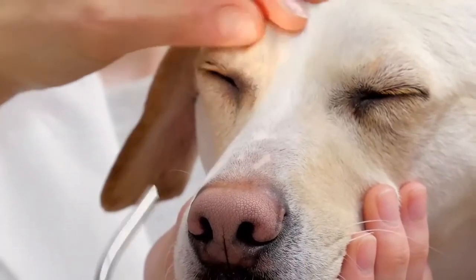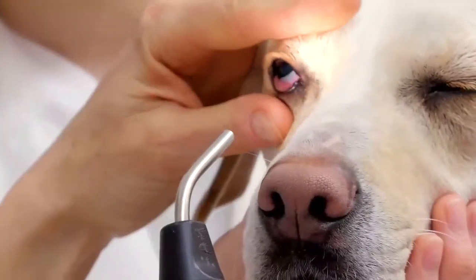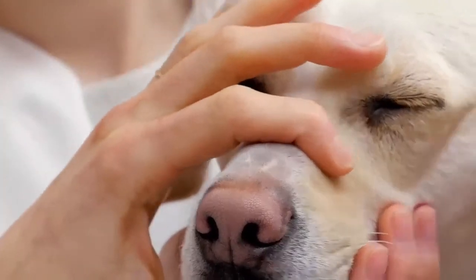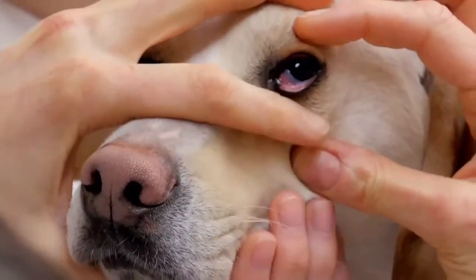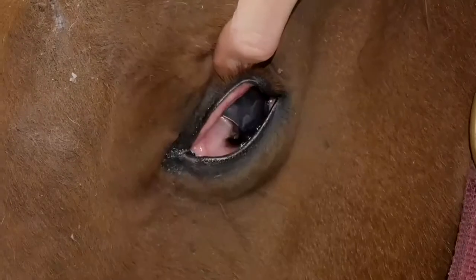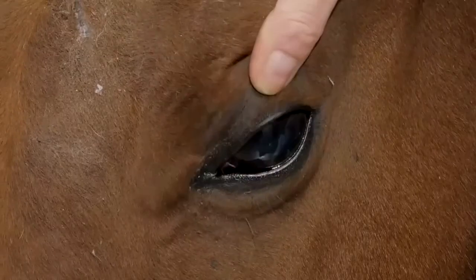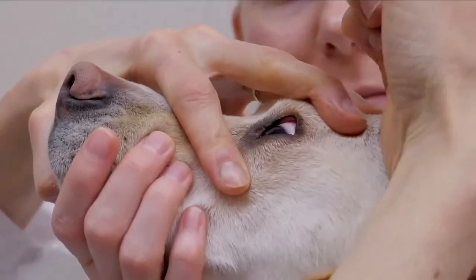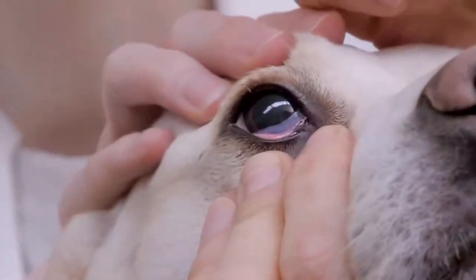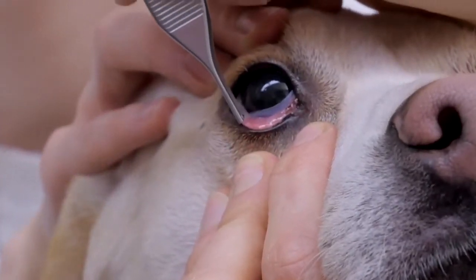The third eyelid, also known as the nictitating membrane, should be examined for protrusion, inflammation, scrolled cartilage, prolapses of the gland of the third eyelid, masses, or foreign bodies. Manual retropulsion of the globe by placing gentle pressure on the dorsal aspect of the eye will cause protrusion of the nictitating membrane to allow for complete examination of its anterior surface. In some cases, such as corneal ulceration, the bulbar aspect of the third eyelid may need to be examined. This can be performed by applying some topical, local anesthetic and grasping the third eyelid with forceps to reflect it anteriorly for examination.